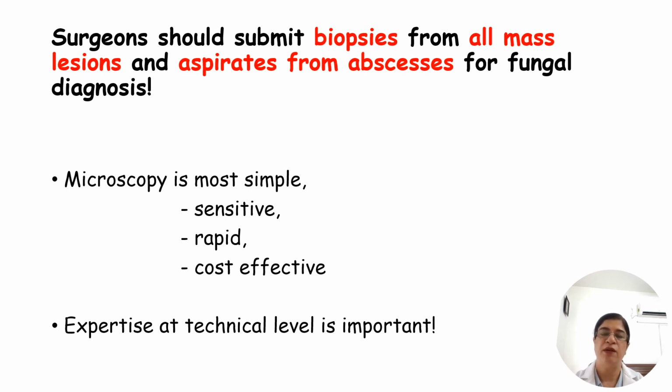Surgeons should be made aware that they should collect samples for mycological identification from any mass lesion or any abscess and submit them to the lab for both microscopy and culture, because now it's being realized that fungal pathogens are responsible for many presentations, like a solitary nodule in pulmonary segments where it can mimic malignancy, or even abscesses.